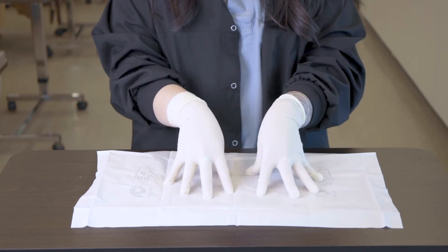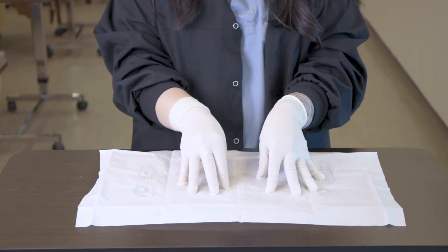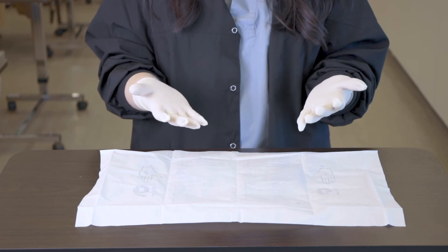If you need to dispose of the package, make sure that you touch it at the center and not the outer edges.